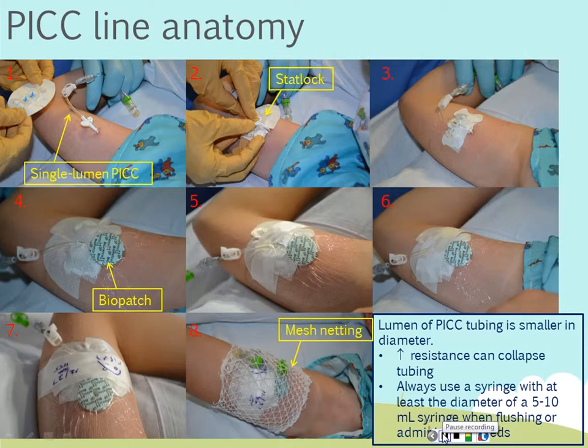Okay, so a couple things to think about when administering medications through a peripheral IV catheter or a centrally inserted IV catheter. I'm going to go back here just because we have a good picture of this cap and the port of the IV. How are we going to prepare this port or the hub of an IV catheter or that primary tubing prior to access?